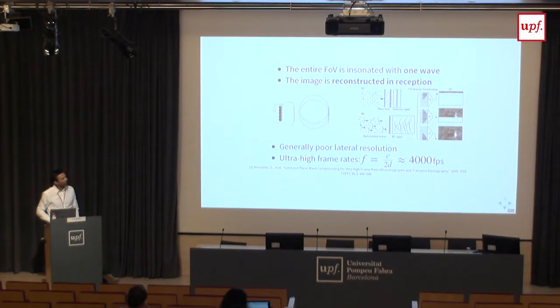So ultrasound already was the fastest modality, at least compared to MRI and so on. And now I actually doubt that MRI will ever catch up to this. This is very fast. Just to give you an idea of how fast this is, if you take a standard ultrasound image, say 60 frames, and you play it with all the frames you would have using this, a single heartbeat would take a couple of minutes to reproduce. So you can imagine the slow motion movie that would generate. It's really fast.